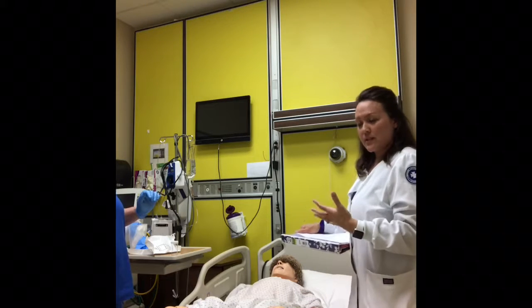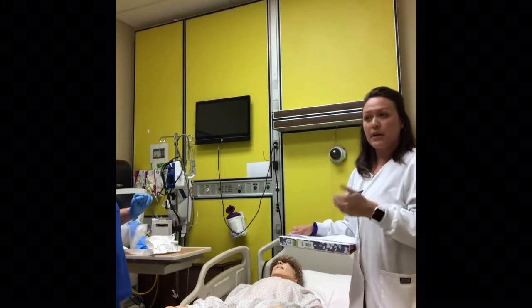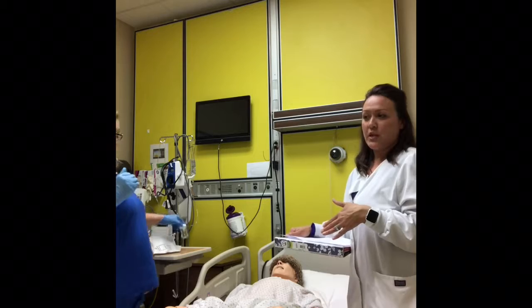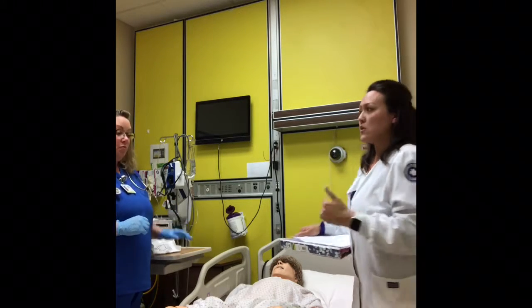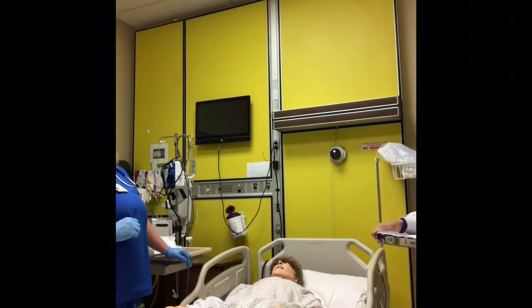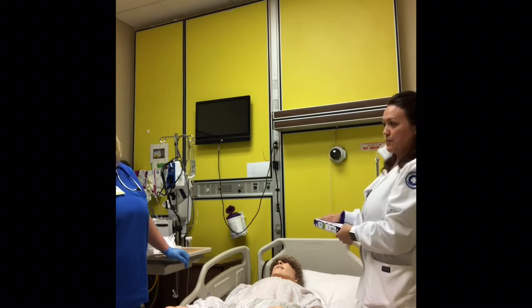Ask the patient to do some techniques to relax, such as breathing, and then try again. And if the male patient is still having a lot of pain, you might need to reassess the situation because the patient could have some prostate issues or some other obstructive issue. This procedure should not be painful. Right.